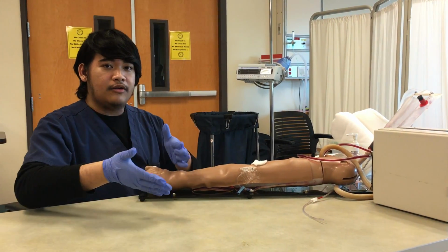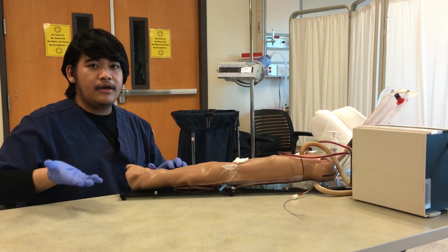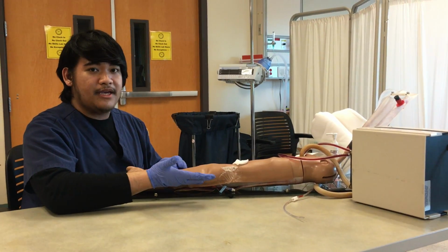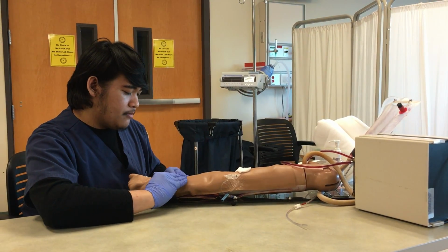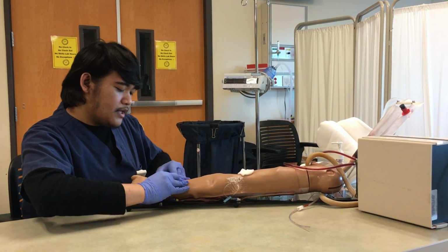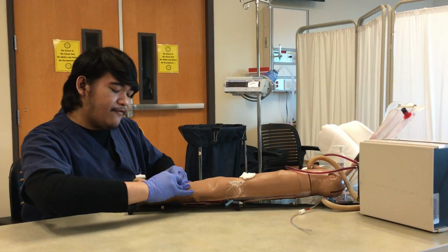So we would go on the other arm for that procedure. Another modified Allen test that we could do for unconscious patients is to occlude again the radial and ulnar and start pushing back the blood, kind of doing it for them.